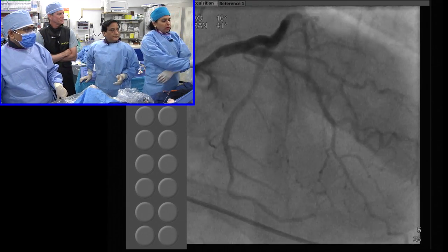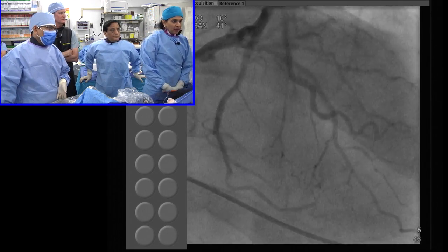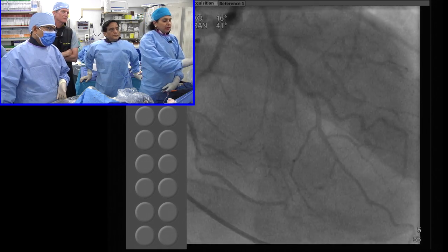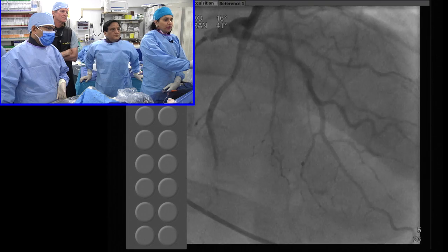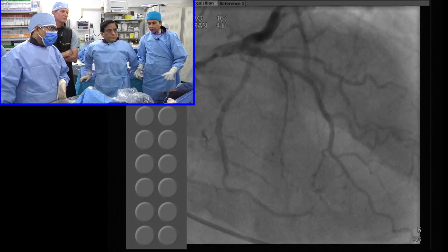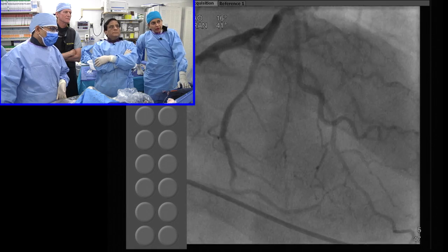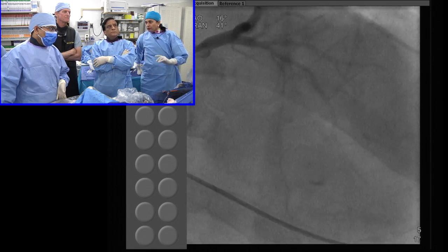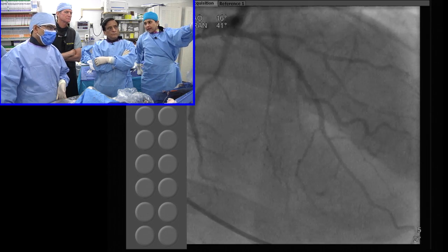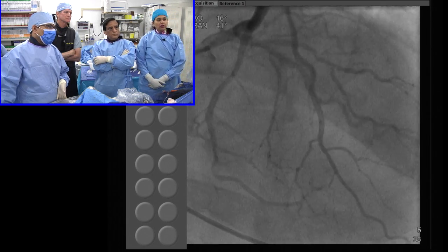Chuck, comments first. Yeah, Anu, go ahead. No, I was just making a point. I am going back to the diagonal: how could we have made it simpler? Once we pre-dilated and placed the stent there, there was a debate, should we go further down and make the angle versus leave it alone. I was all for leaving it alone, but the other debate was to make that angle, and that is where we took longer once we decided to go further down. Before we started, our plan was to stay before the bifurcation, and if we had placed the stent just about there, we would not have taken longer for the diagonal.